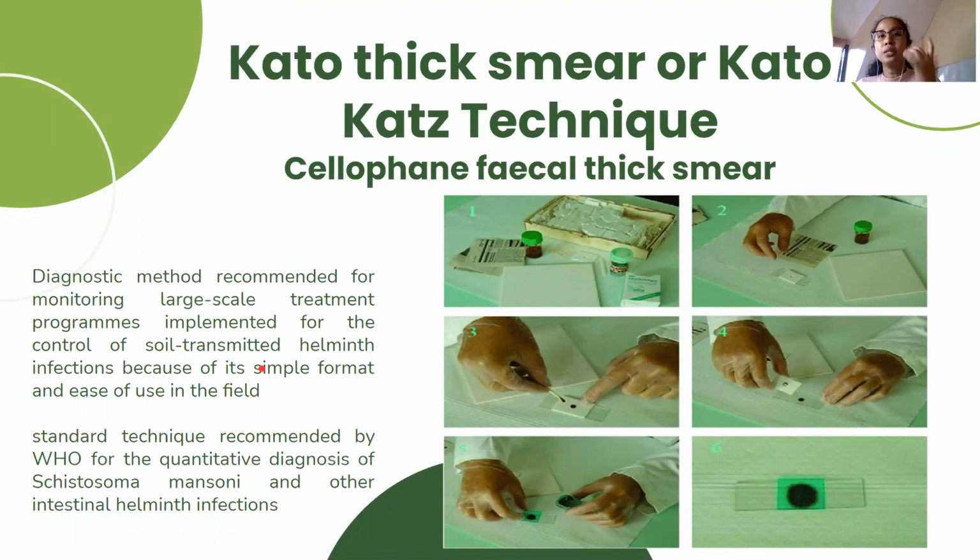helminthiasis. So, class, you could do this while you are in the field. Apparently, you perform deworming in that community, and after a few weeks, you want to test if there are still people who are positive with helminths, soil-transmitted helminthiasis.